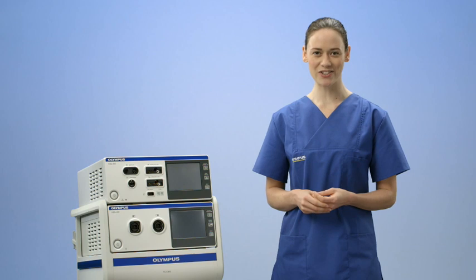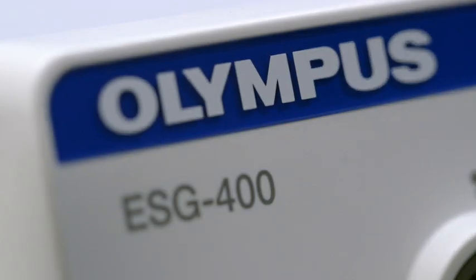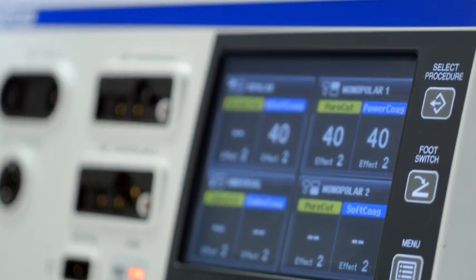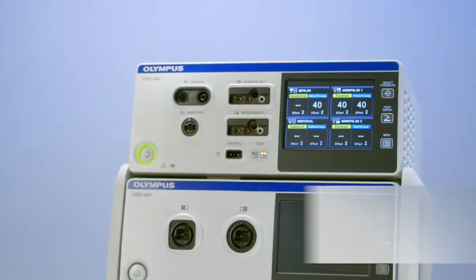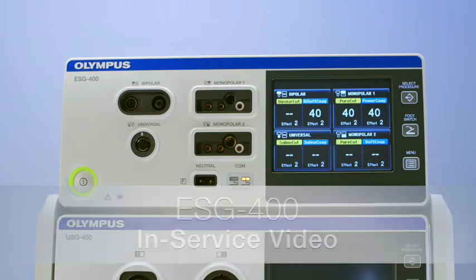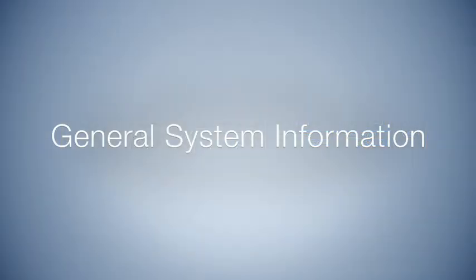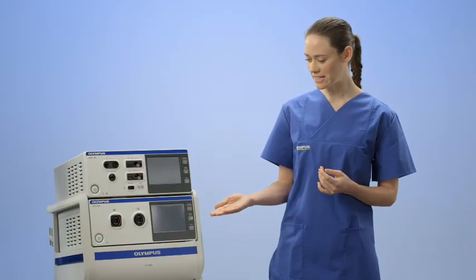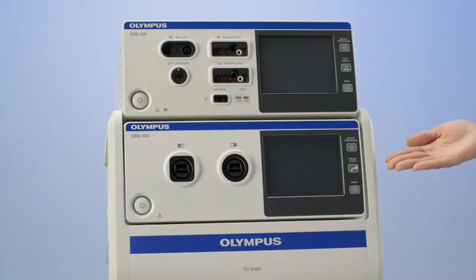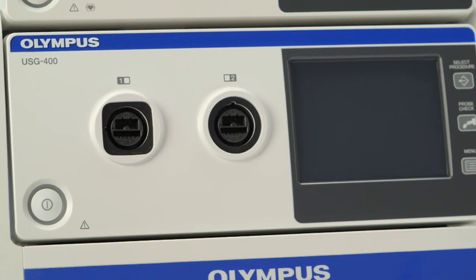Welcome to the ESG400 in-service video. This is the Olympus Surgical Tissue Management System. The system consists of two generators. The first generator is an ultrasonic surgical generator called USG400, which supplies energy for the Olympus ultrasonic dissector called SonicBeat and the hybrid device called ThunderBeat. This video will deal mainly with the functions of the ESG400.